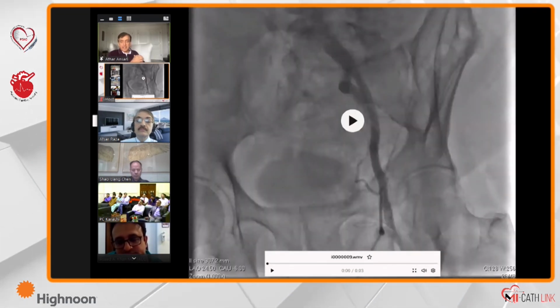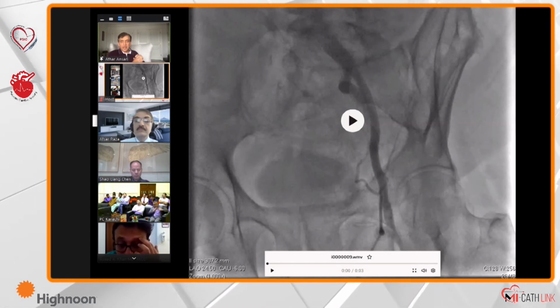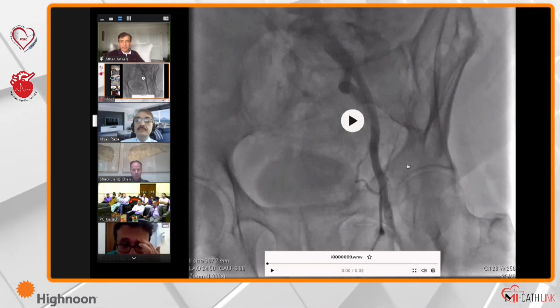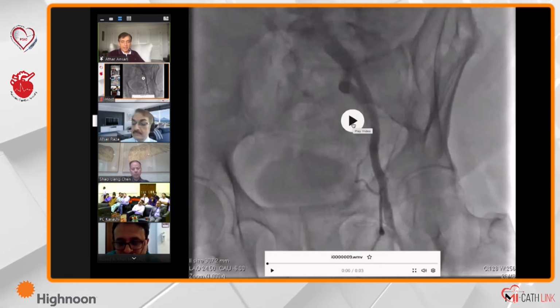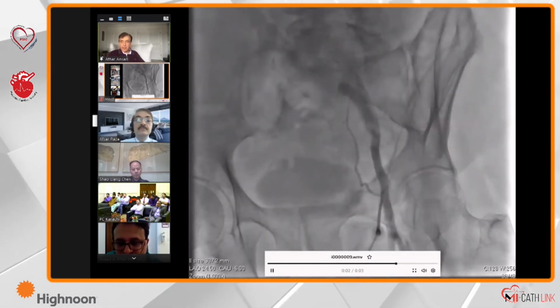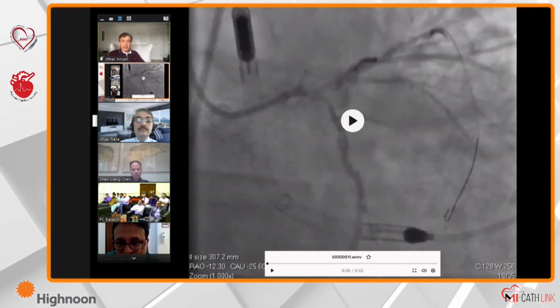And simultaneously, we decided, rather than the balloon pump, to put an Impella device from the left side. So within the next 7-8 minutes, this was the left side approach. The patient was done from the right side, the Impella. And then next one followed by, so you need to do a wire and do a PCI.